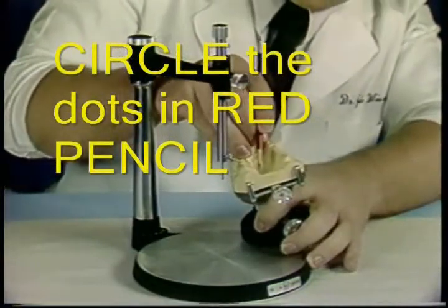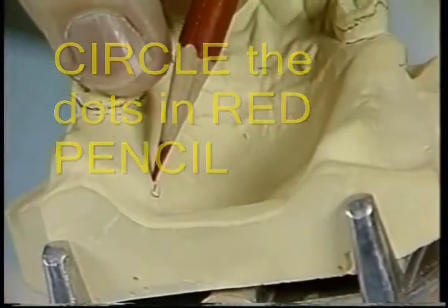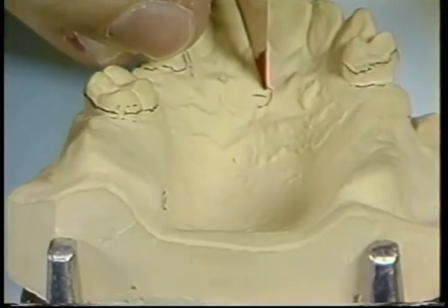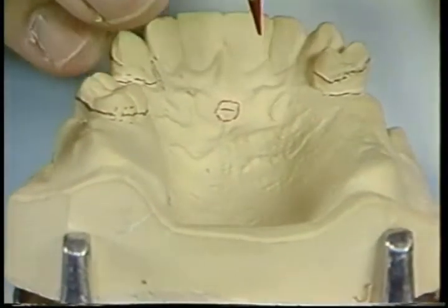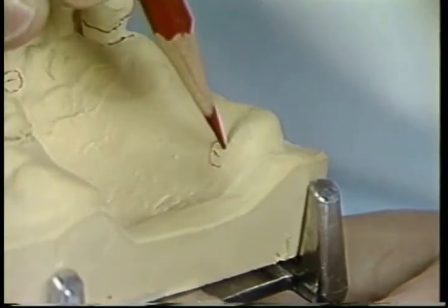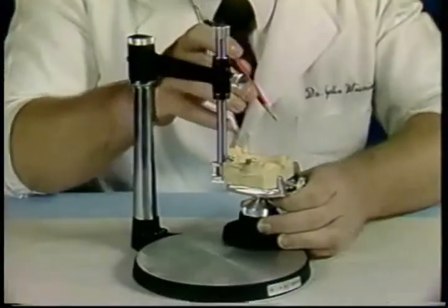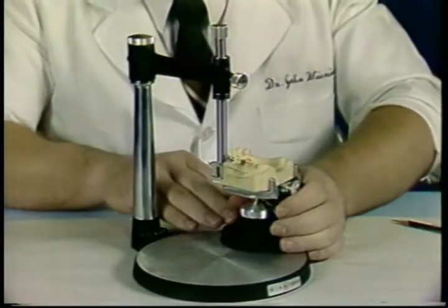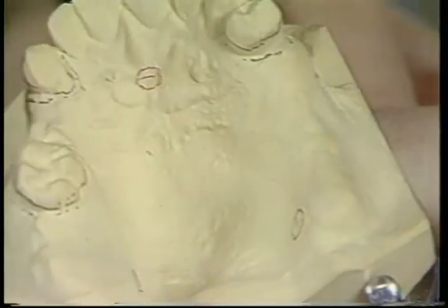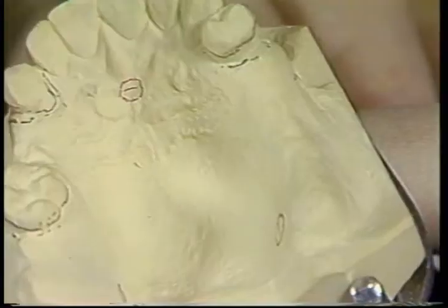Circle these 3 marks in red pencil to distinguish them from stray carbon markings. You are now ready to proceed with designing your partial denture. The cast may be removed and replaced as necessary.